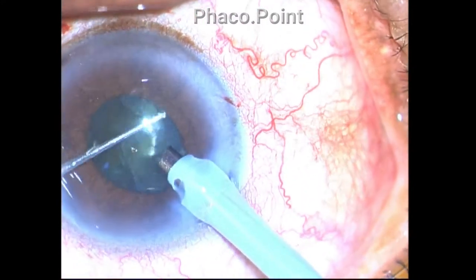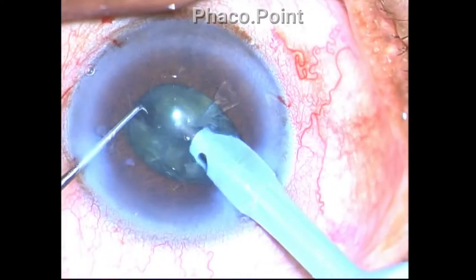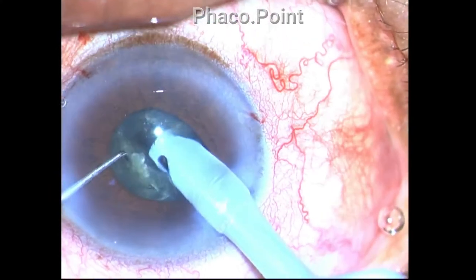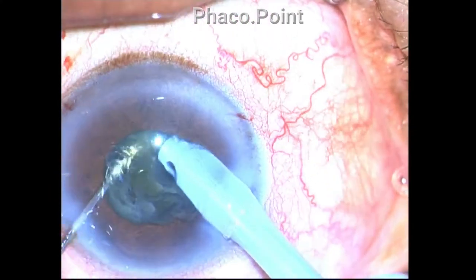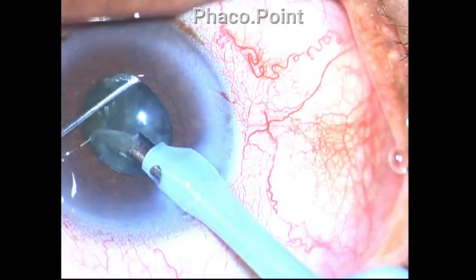Since I am employing the direct phaco chop, I continue by making multiple chops. The machine I'm using is a Stellaris machine with vacuum on demand.